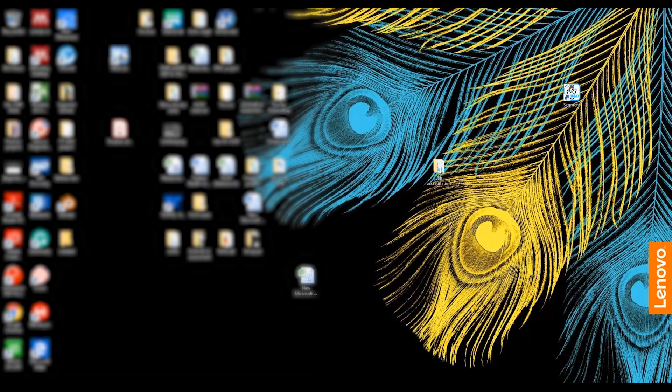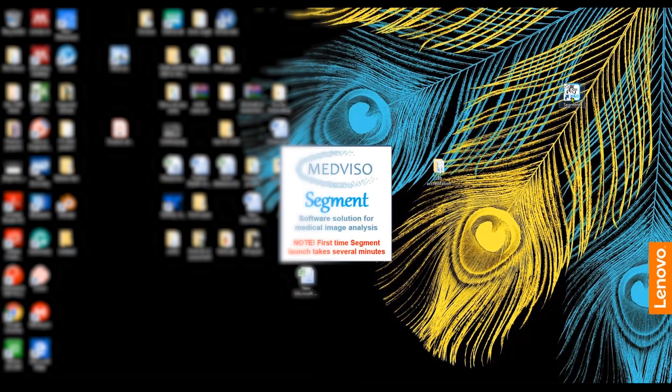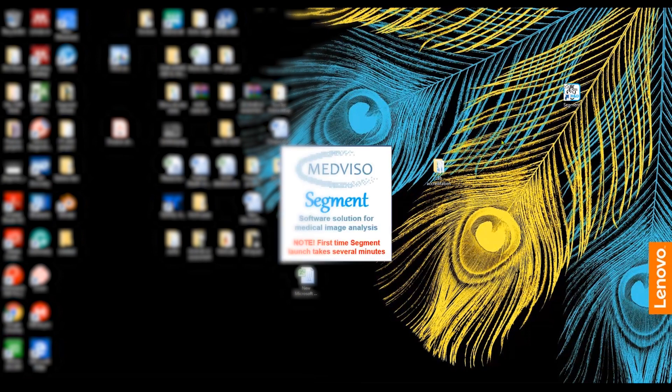I'm using the latest version of Segment, Segment version 3. I'm going to double click the Segment icon on my desktop and just wait for a while until the program starts.